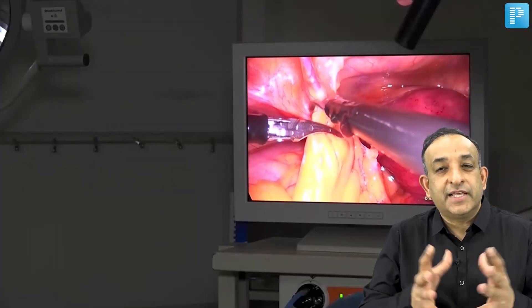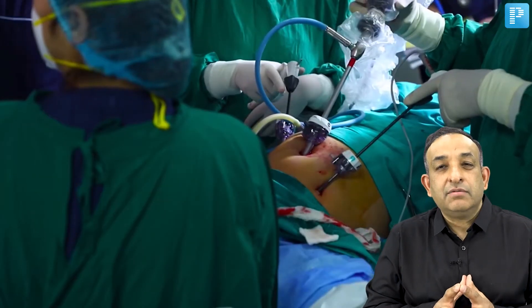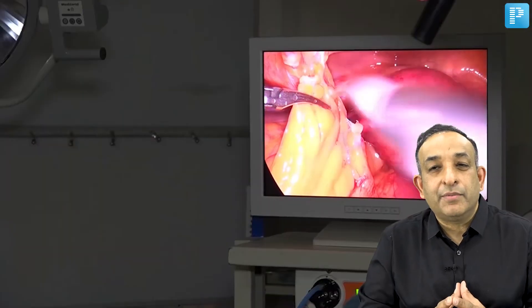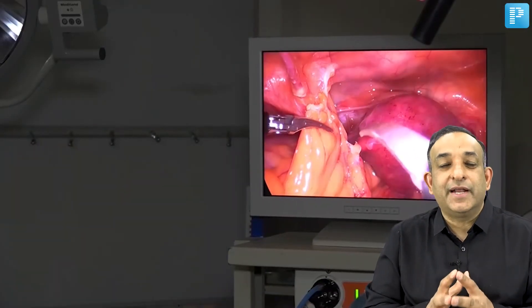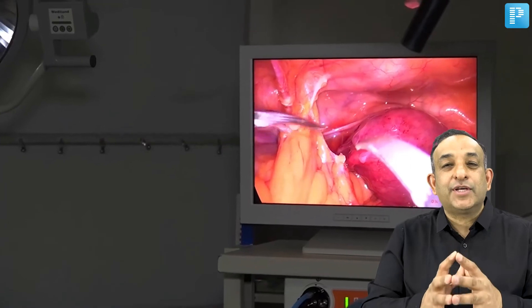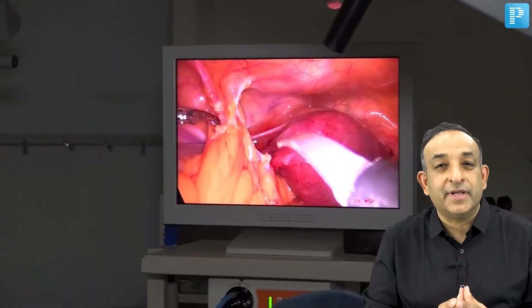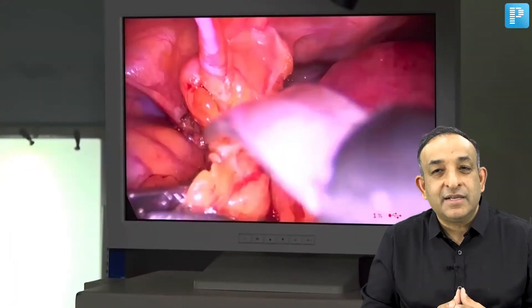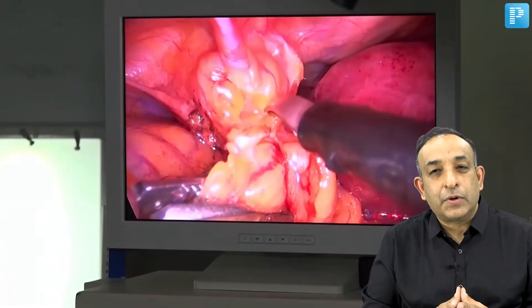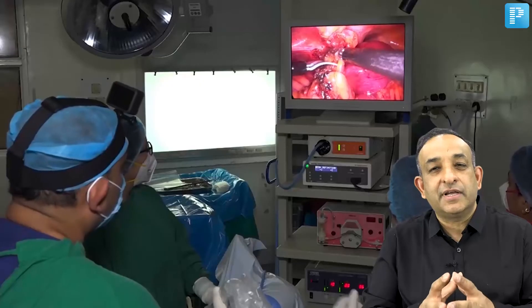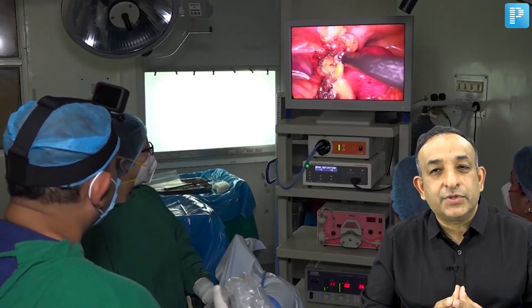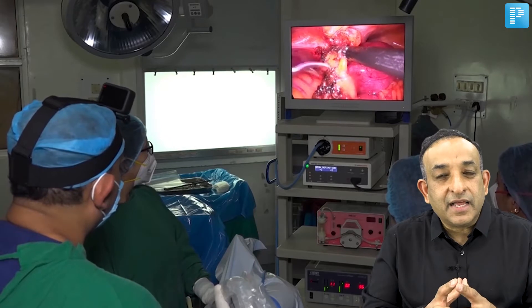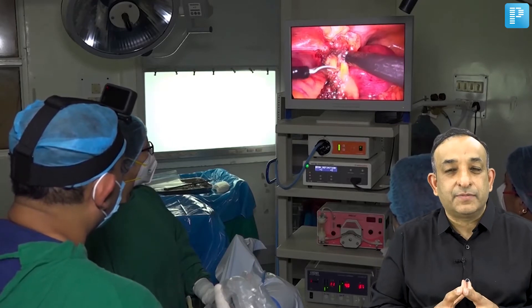I add another port so I can use scissors and graspers to perform adhesiolysis more easily. This three-port operative laparoscopy involves a painstaking, lengthy adhesiolysis to properly visualize the uterus and tubal anatomy. I am using monopolar cautery and scissors to take out the omental adhesions — only after adhesiolysis can you properly assess the tubal anatomy.